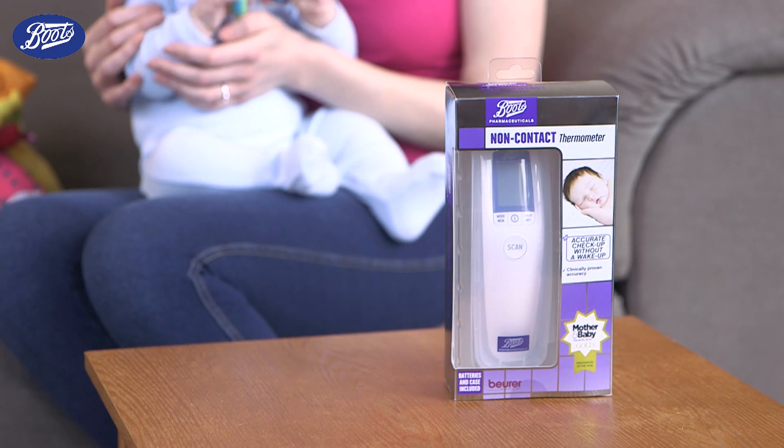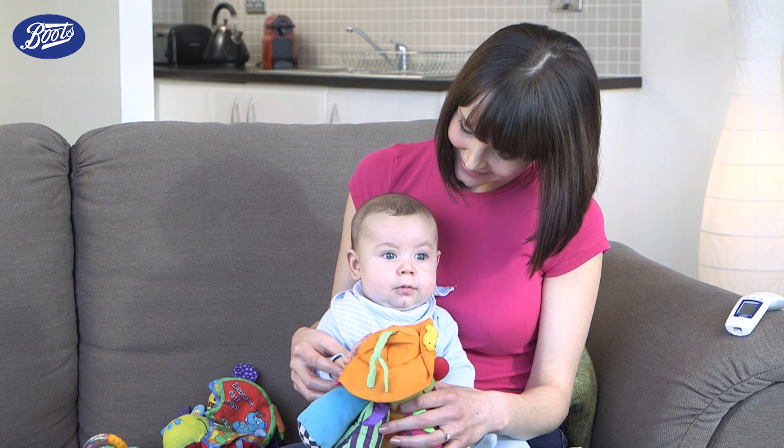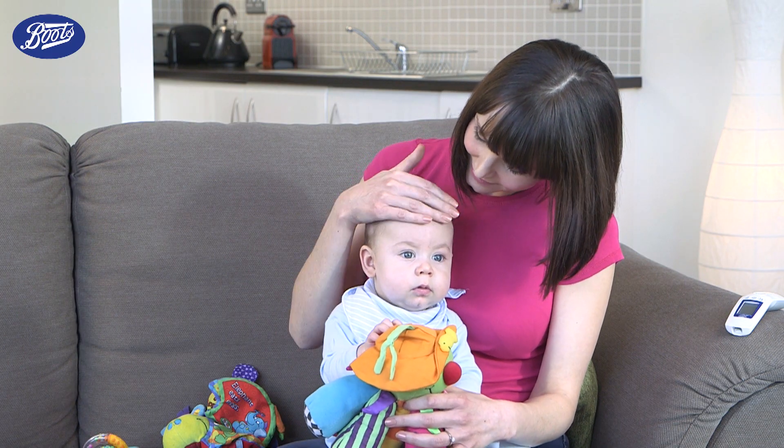The Boots Pharmaceuticals Non-Contact Thermometer lets you measure temperature without contact, so when your baby's ill there's no need to wake or disturb them.